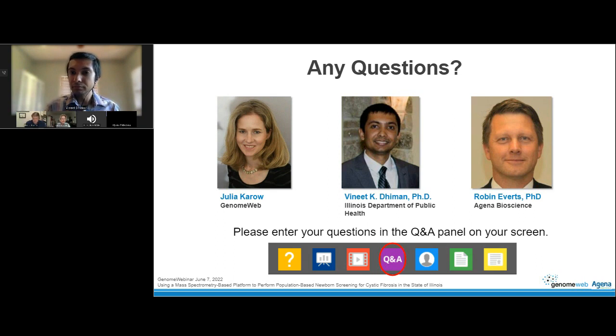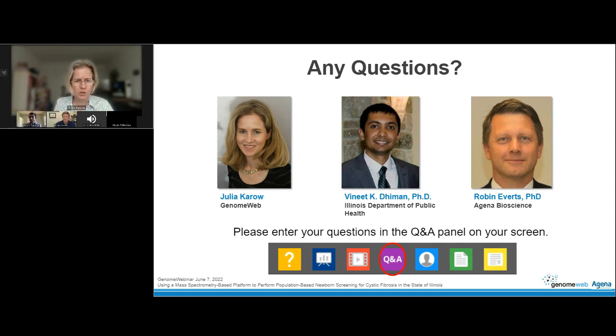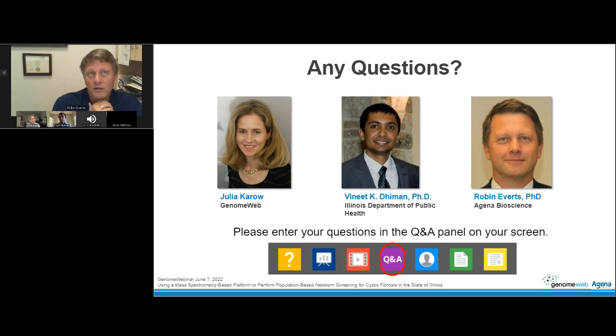Okay. And then a question probably for either of you. Is the Agena assay able to detect a whole CFTR gene deletion or a partial duplication of the gene? Well, I can take that question. So we have not designed an assay for a whole gene deletion, but we do have the exon 2, 3 and exon 22, 23 deletions in there. But if you know what you're looking for, if you know what the boundaries are, it's easy to design on the platform. That's a nice thing. It's an open platform, so as long as you know what you're looking for, it can be designed on it.